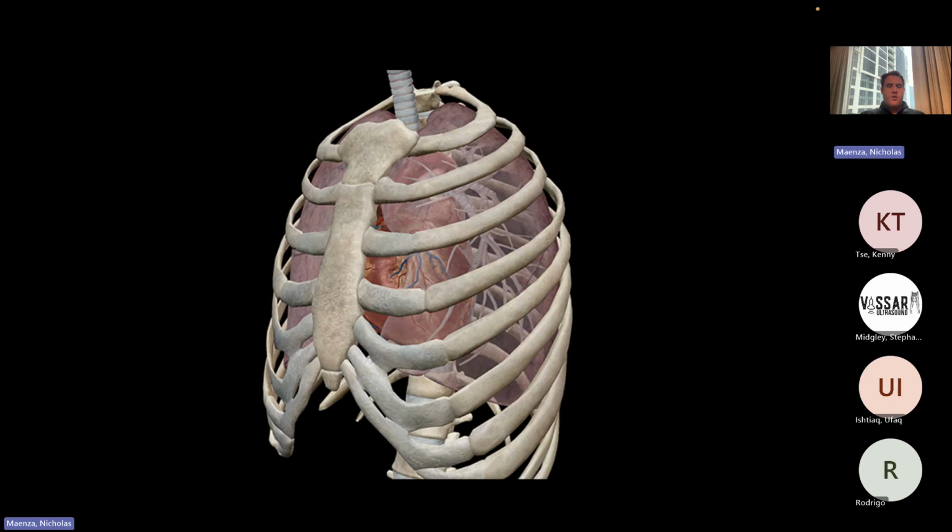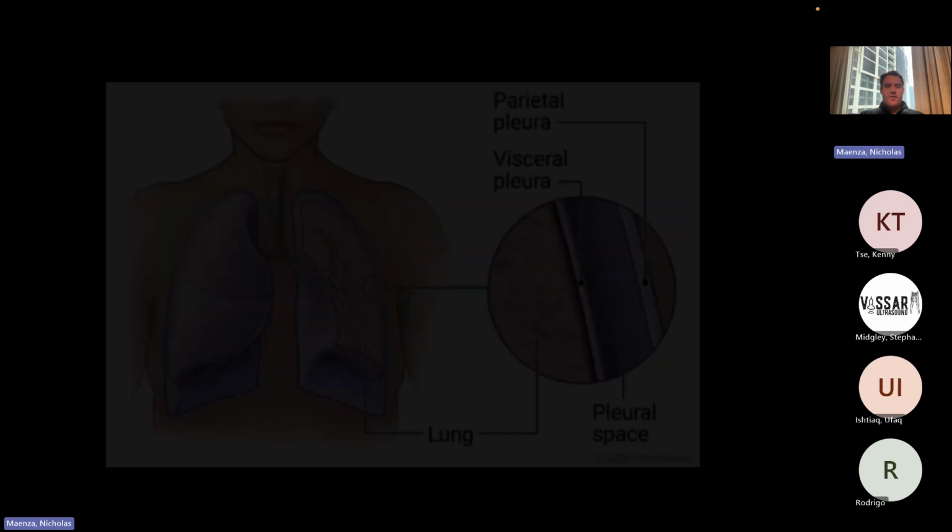All right, so the anatomy. We're keeping it really simple, starting from the beginning. Obviously, there's skin, there's subcutaneous tissue, there's some muscle layer. Then you get down to the actual rib cage, and you can see the lung underneath the rib cage. I know you're all physicians. This is super straightforward. It's just important to hammer home that the ribs are over the thorax, over the lung, because that plays a big role in lung ultrasound.